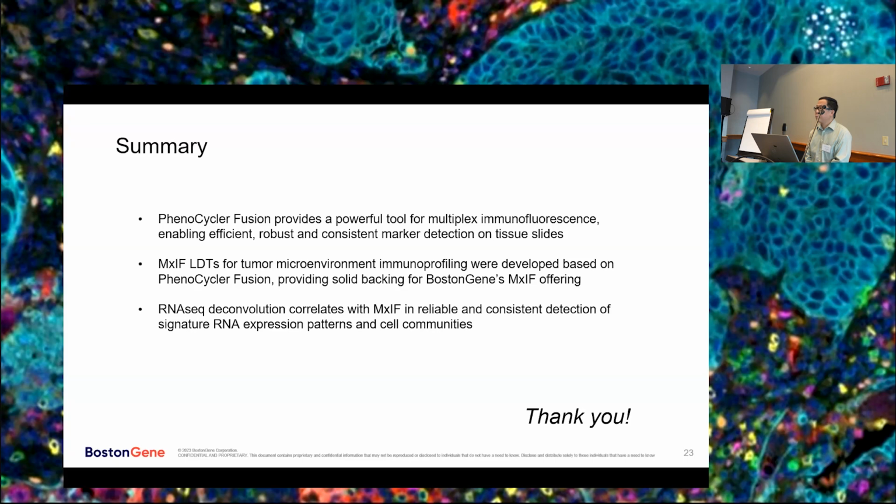How do you solve that problem when there is a co-localization, maybe four markers co-localizing together? I think the validation is based on the staining, not on cell types. So we don't care about co-localization. We just quantify that specific staining.